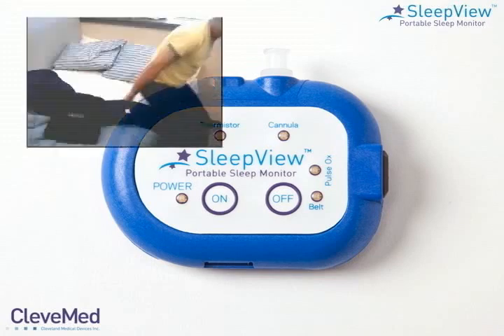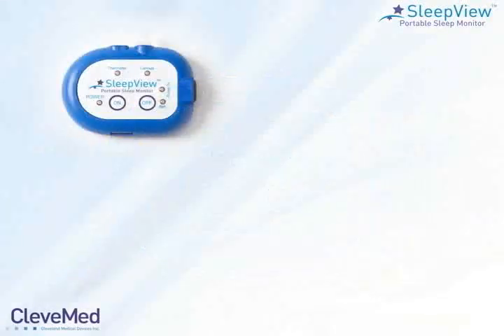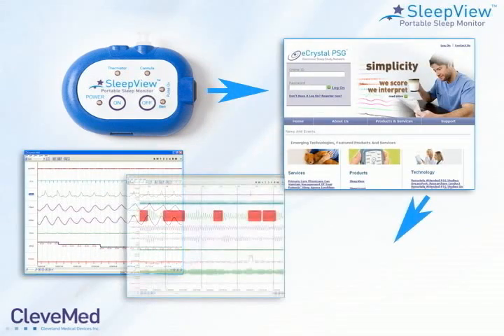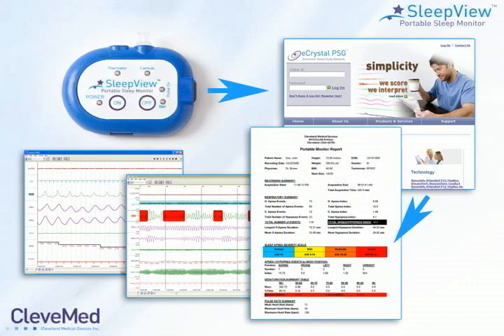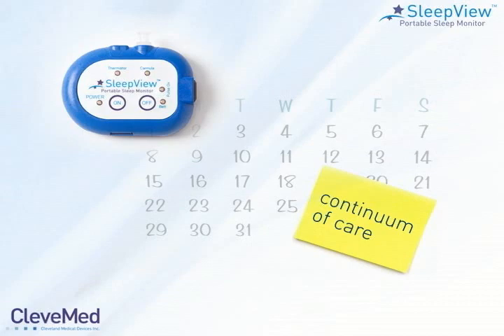SleepView is ergonomically designed for patients to perform a self-test at home. SleepView works hand-in-hand with the eCrystal web portal, where sleep studies are uploaded for review, scoring, and interpretation into a sleep study report. This practical and efficient patient monitoring system allows physicians to provide their patients with a continuum of care for sleep disorders.